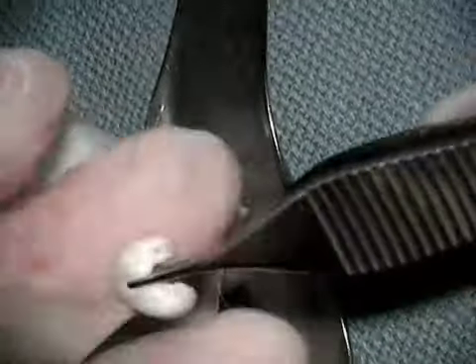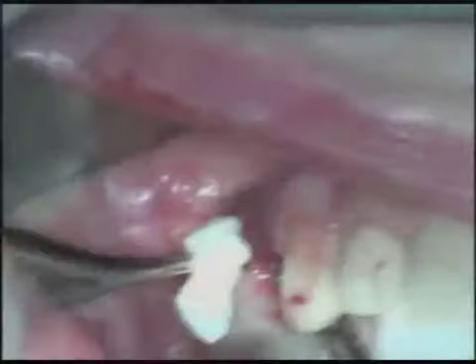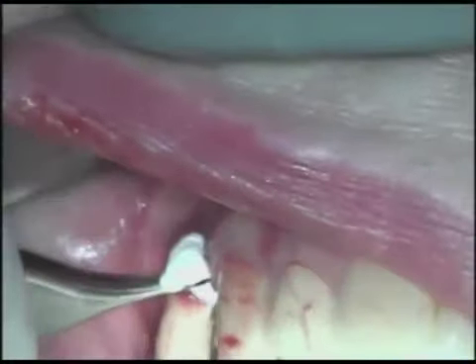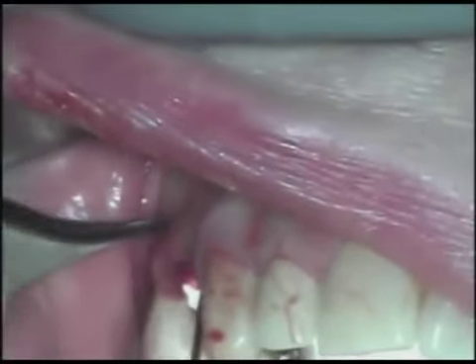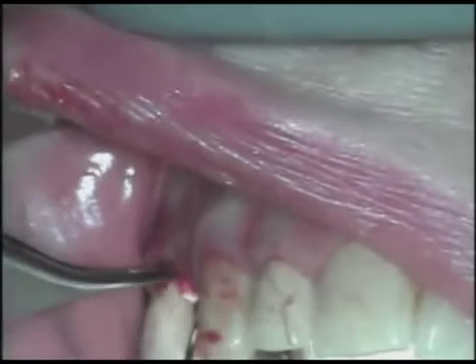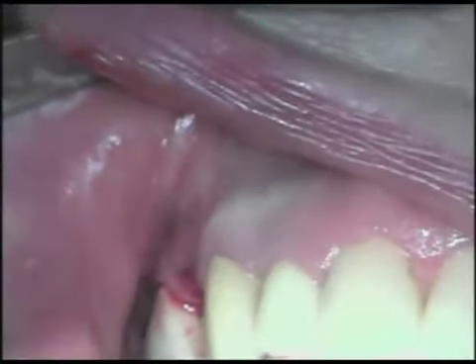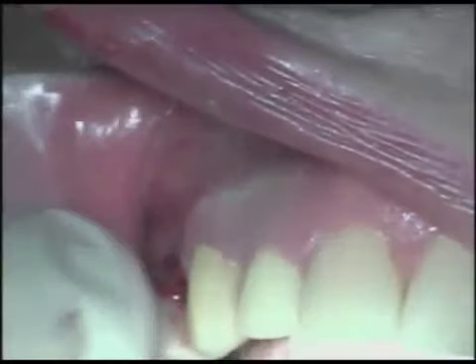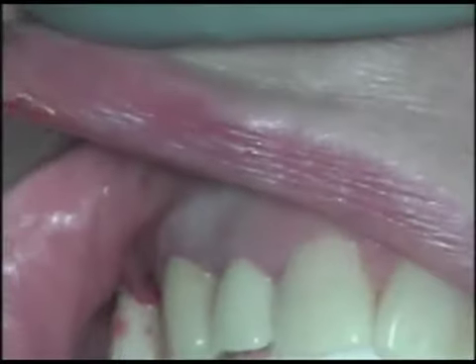Now this is not a great barrier membrane like, say, Gore-Tex would be, but it works well enough for our purposes, and it fits in that space, and it's resorbable, so we don't have to worry about going back to ever take it out. So I'm going to put that into place, and again use my periodontal probe to pack it subgingivally and around the abutment. And sometimes it takes a little bit of teasing to get it in just the right spot. And there we go. Tissue looks pretty good. Remember, we did this with basically completely flapless and minimally invasive extraction.